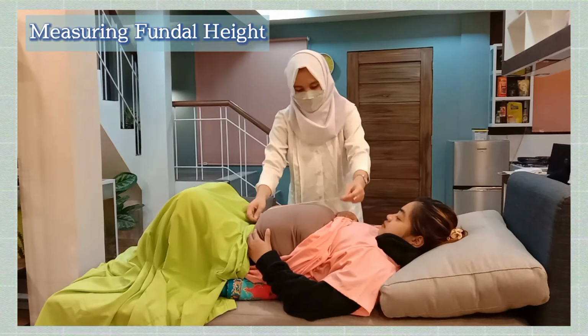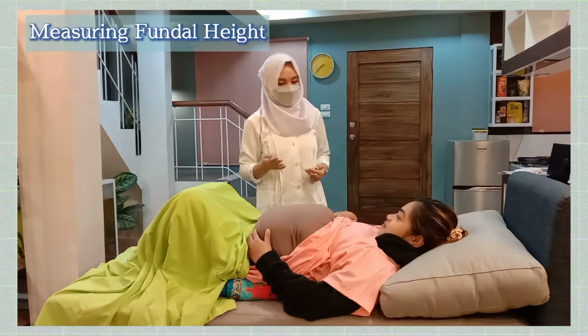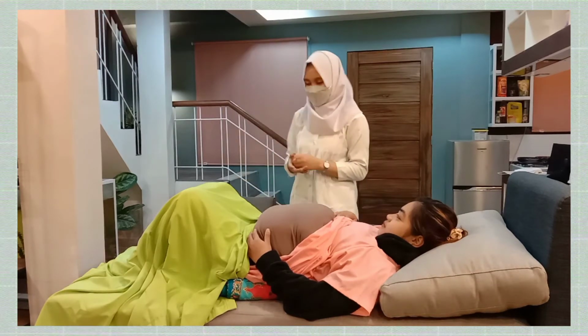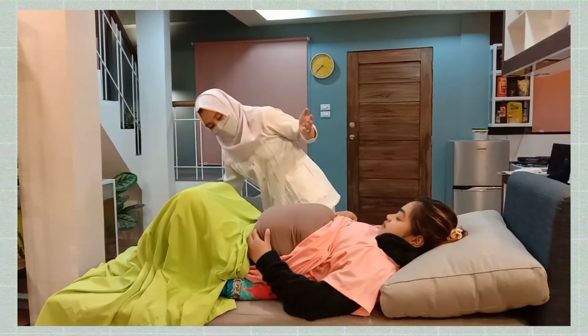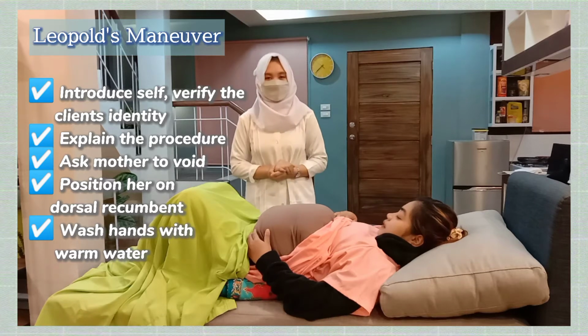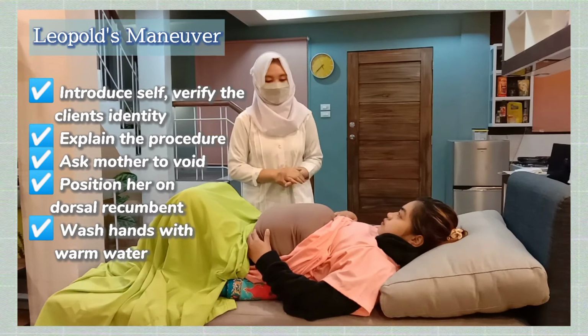This measurement po, ma'am, is used to determine the age of gestation of the baby through McDonald's rule. Now we have done measuring your fundal height po, let us proceed with the Leopold's maneuver. Since you have already emptied your bladder, we will now start.